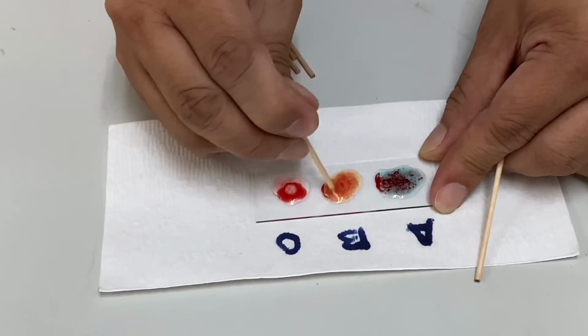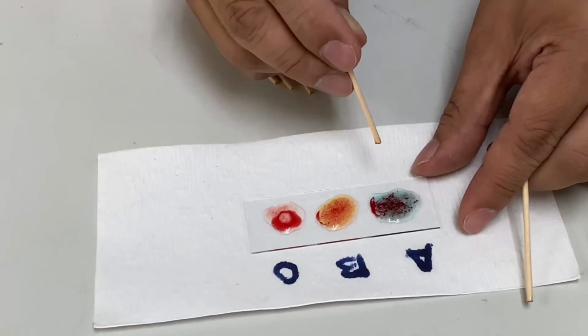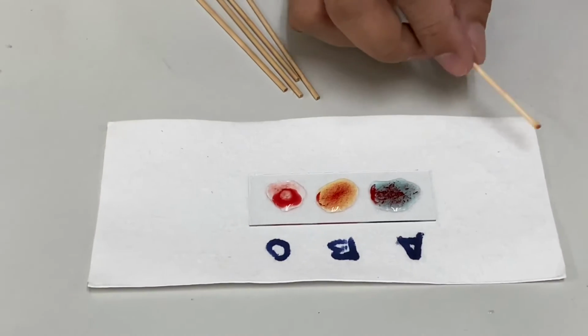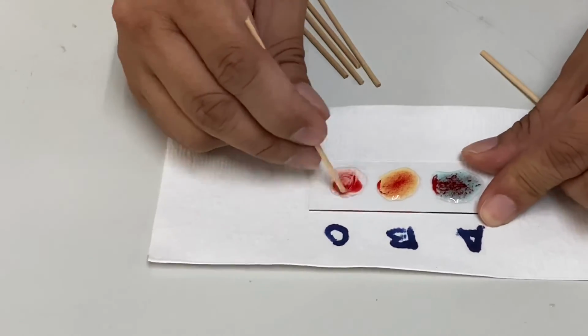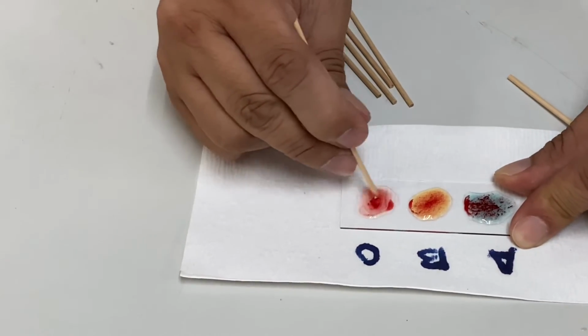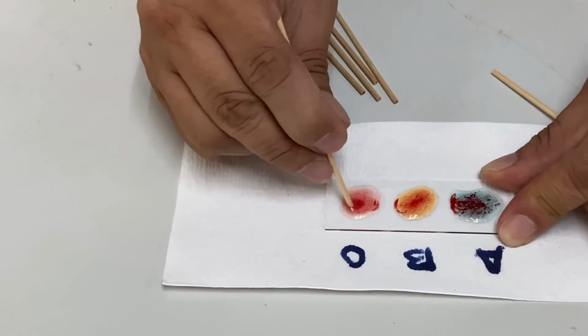None, sir. Now, you can see the precipitate in there. That's the agglutination. So now let's see. Majority of the Filipinos are actually positive. Okay? Now, Von has a royal blood.